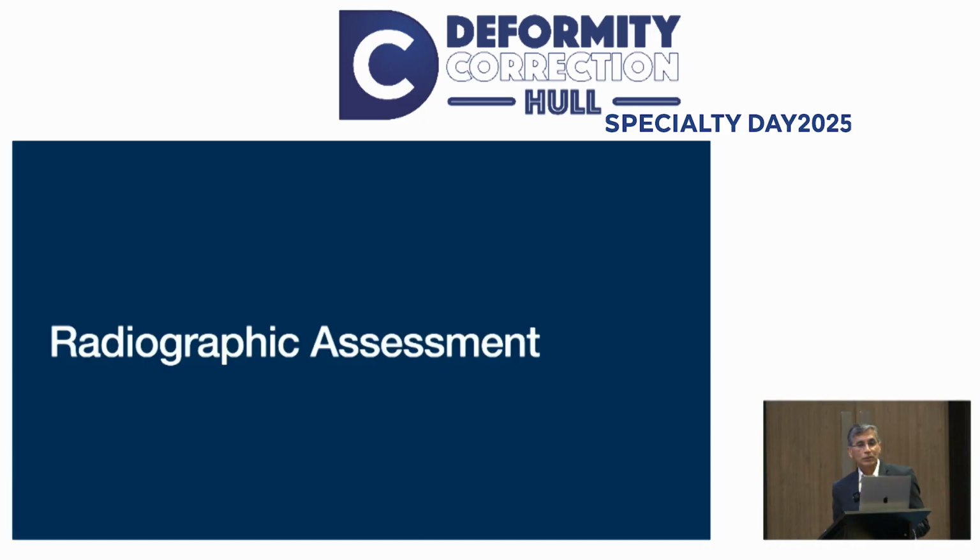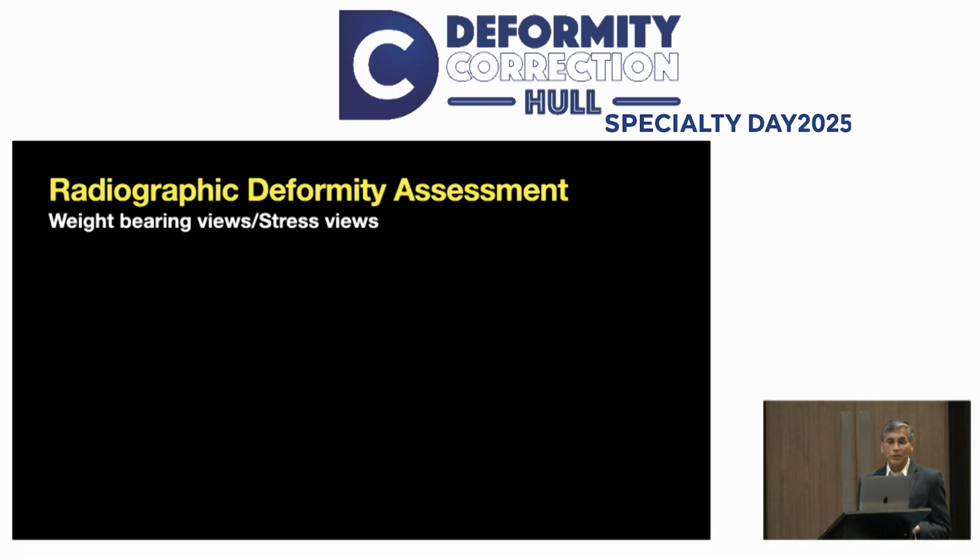So now we move on to radiological assessment. Do not order an X-ray without doing a thorough history and clinical examination. It doesn't make any sense. And every foot and ankle X-ray should be weight-bearing. If they can't weight-bear, go and do a stress view.